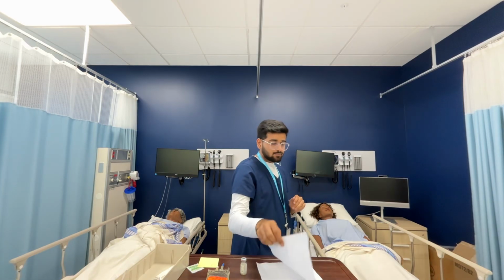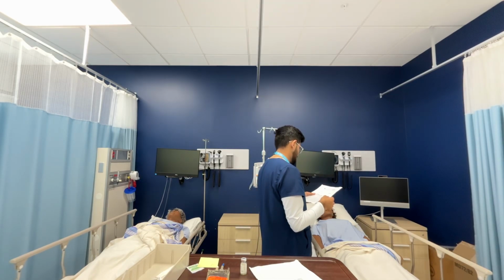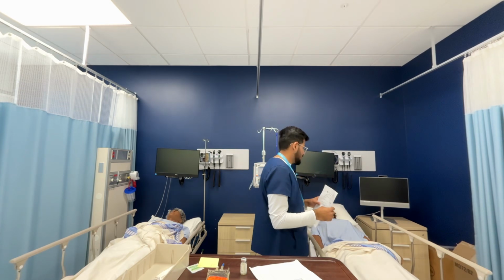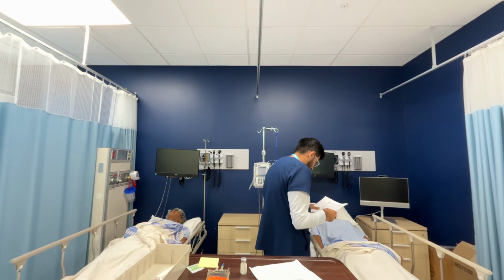I have my mask. Hi Miss Fiona, my name is Shubham Chaudhary. I'm a practical nursing student from Sheridan College. May I know your name and date of birth? I've confirmed her name and date of birth. Fiona Sherrick, February 25, 1980. It's confirmed. Miss Fiona, I'm here to give you your pantoprazole medication, 80 mg through IV.